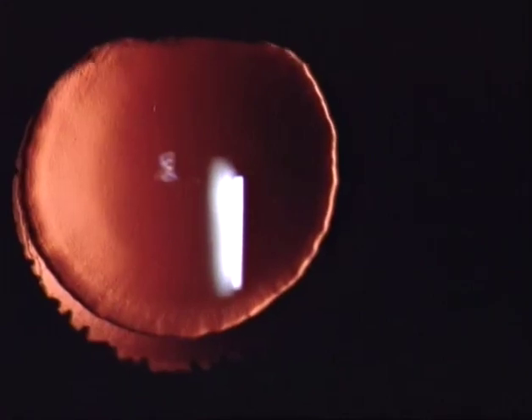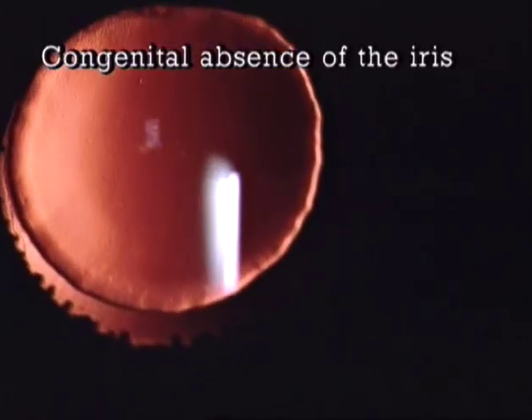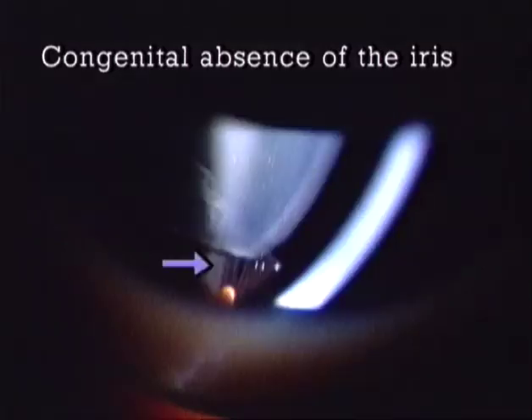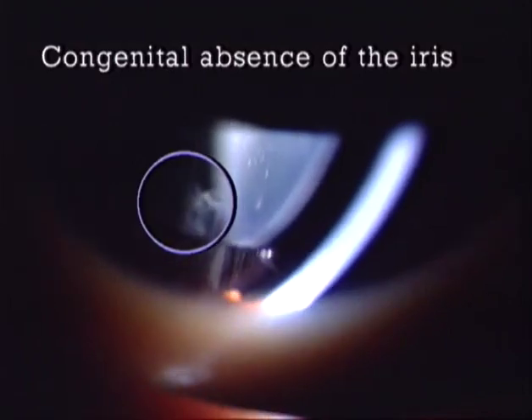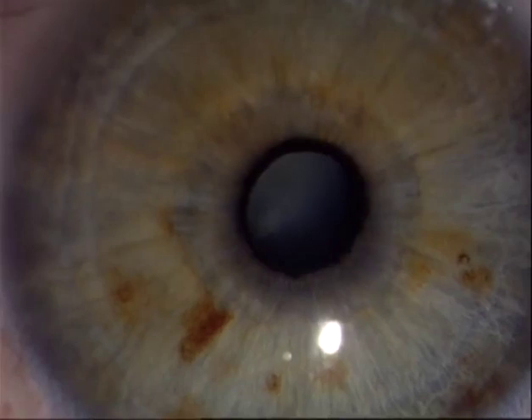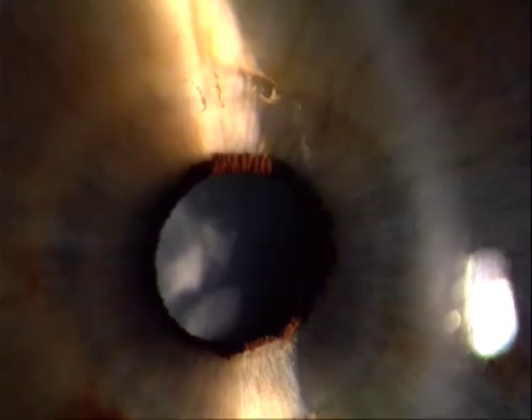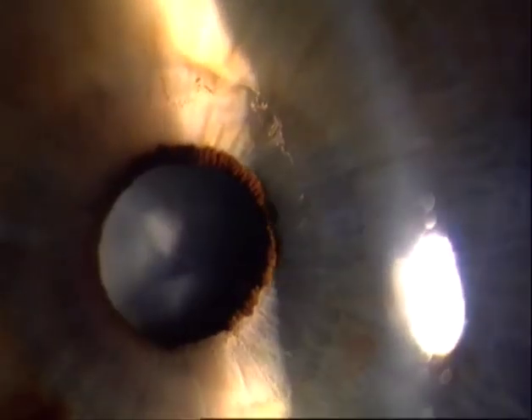This is possible, as shown here in a case of congenital absence of the iris, by special techniques which allow one to see the transparent cornea, the transparent lens, the transparent zonules, and the transparent anterior vitreous. For this purpose, the slit lamp, besides allowing the examination of visible tissues in great detail, as shown here by the example of floating remnants of a pupillary membrane of the iris, also offers additional methods for examination.